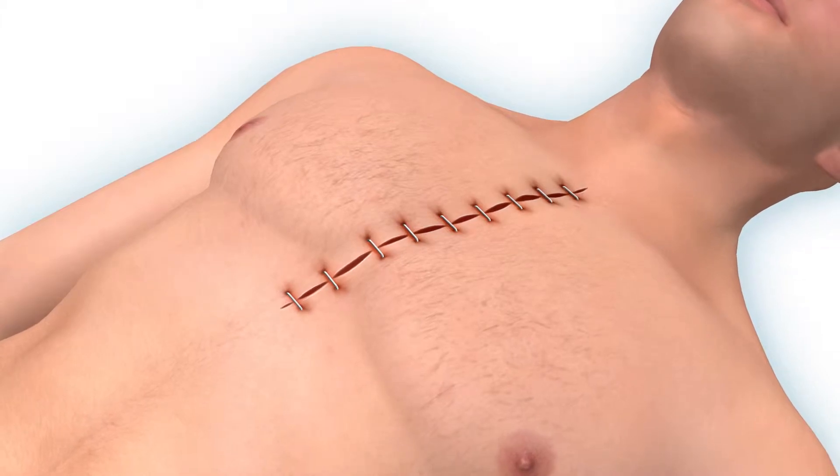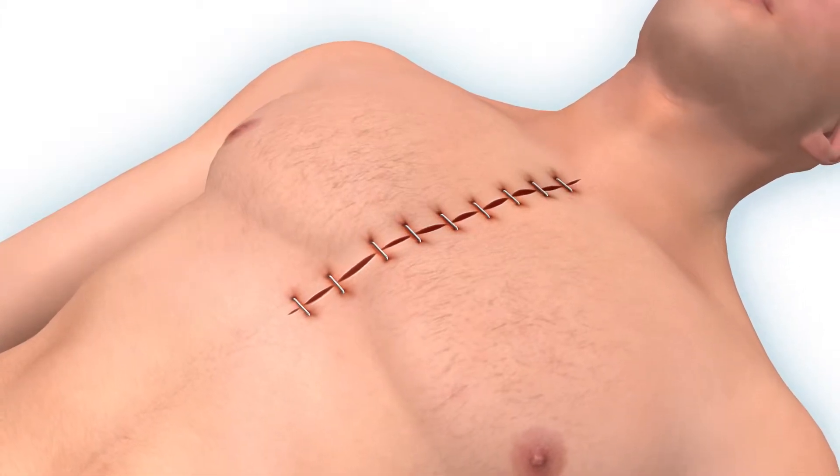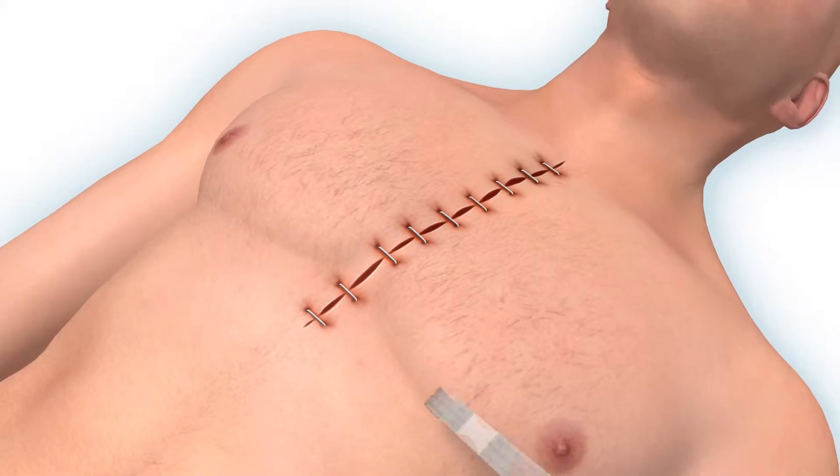Closed wounds under high tension are susceptible to pain, inflammation, dehiscence, and hypertrophic scarring.